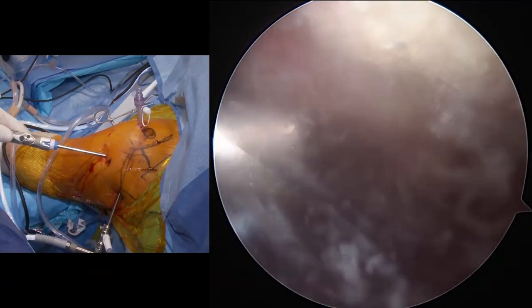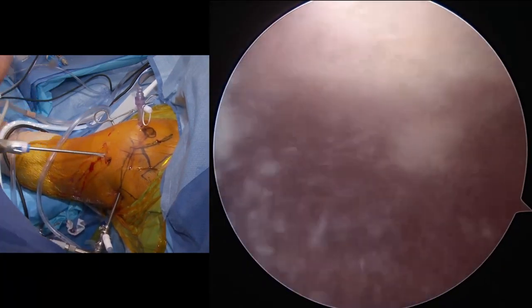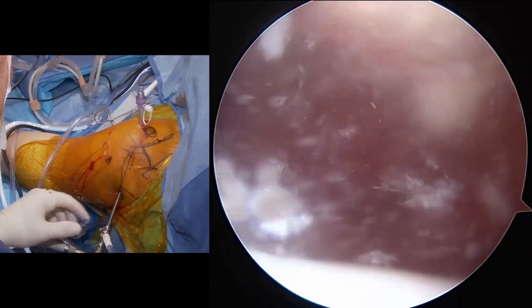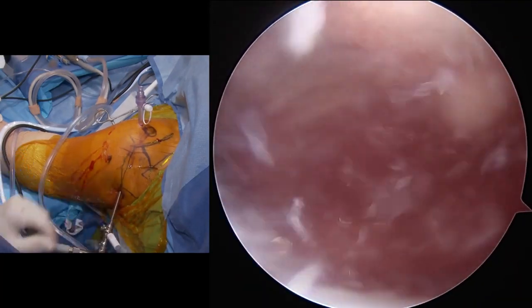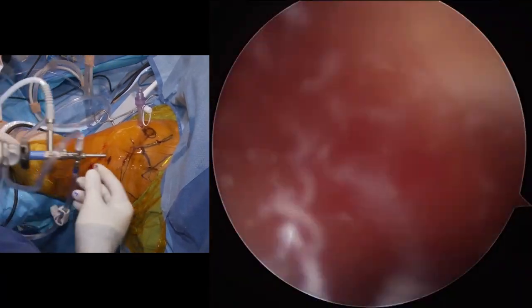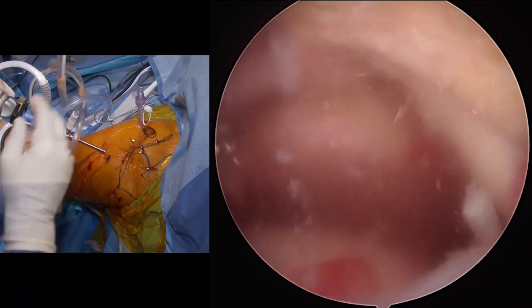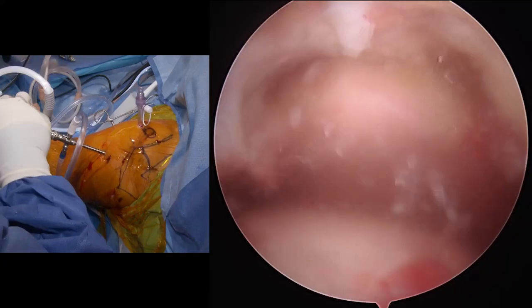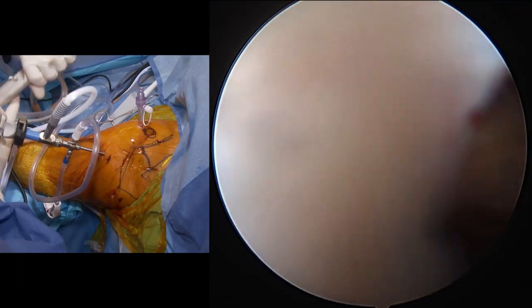So we're pretty close to that now, and once we get pretty close to finalizing that, we'll go ahead and take out some of the bone debris that we see. And then we'll take the shaver and switch from the posterior to the lateral portal so we get a sideline view of everything that's going on. And again, I really am not excited about the view that we have. This is terrible imaging.